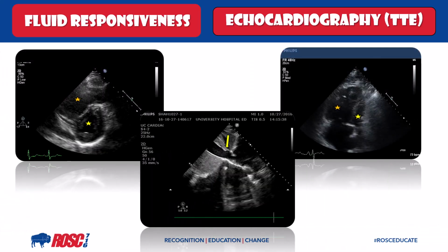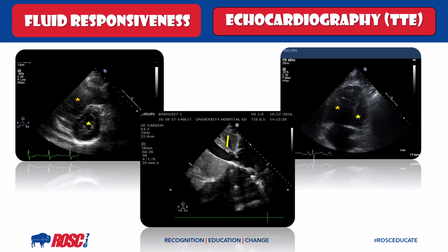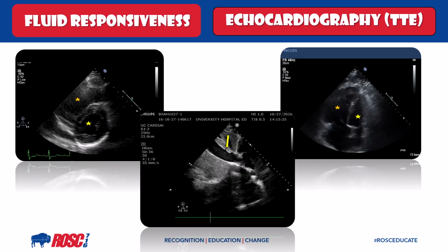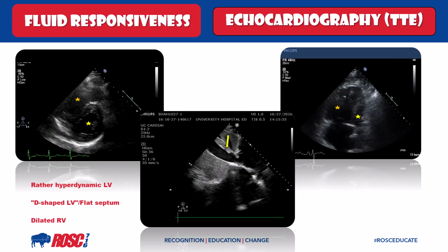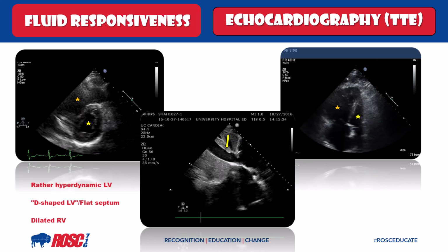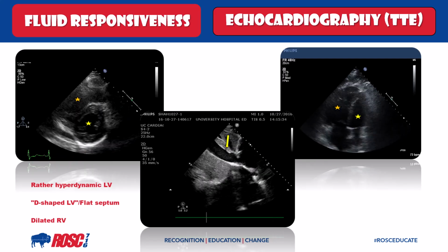The upper left window is a parasternal short axis, and the upper right window is a four-chamber view, and in the middle again is another image of the IVC. Taking a look at the left upper window, the parasternal short axis, you might initially feel that the left ventricle is hyperdynamic. Well, it is, but there's other things to point out in this image. First of all, the septum is flattening. That LV almost looks like a D. And if you take a look at the RV, which is the orange star, it's massive. So whether this is pressure or volume overload, it's pushing into the interventricular septum.